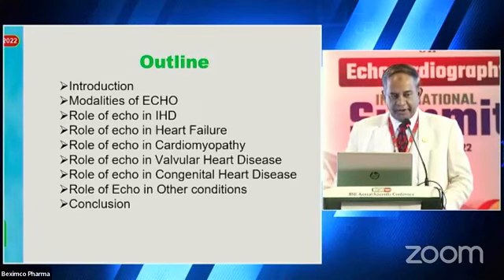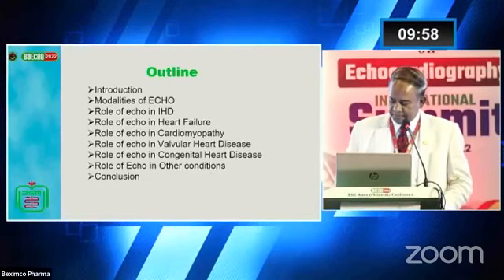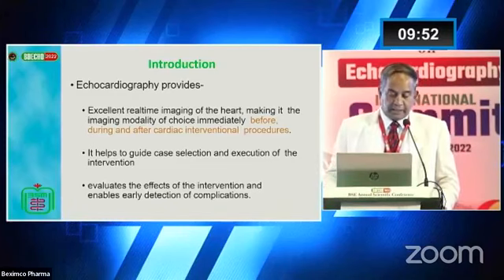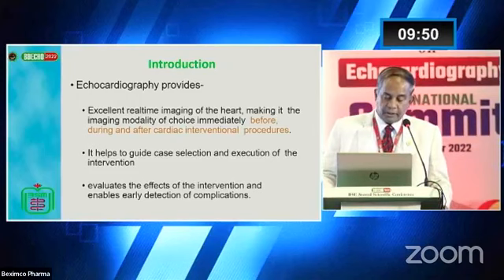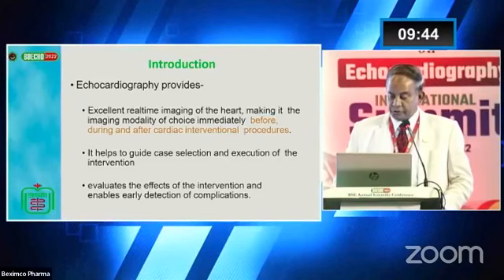Intervention is everywhere. Echo of the heart makes it the imaging modality of choice immediately before, during and after cardiac interventional procedures.